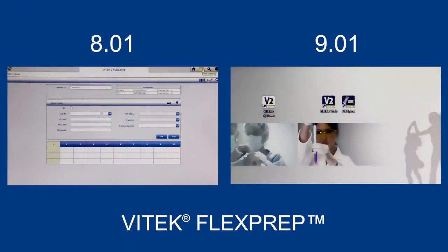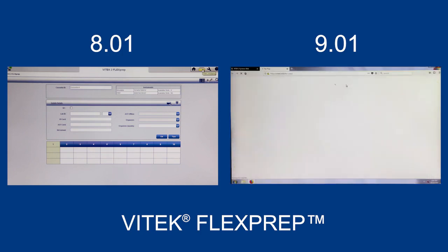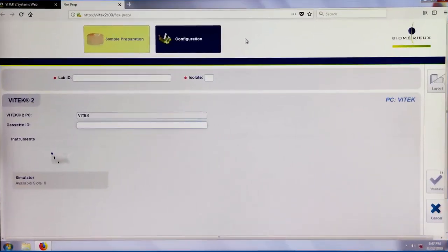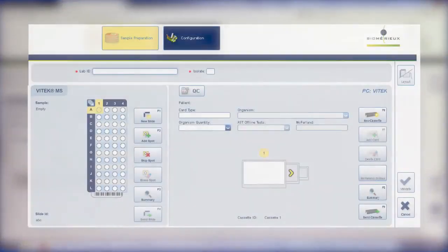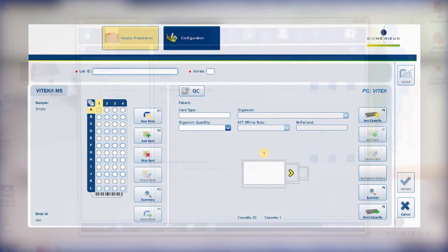Vitek FlexPrep in 8.01 was part of the web application and could only be utilized to set up Vitek 2 cassettes. In 9.01, Vitek FlexPrep has been moved to its own application. Coming soon, Vitek FlexPrep will support the definition of a Vitek 2 cassette and a Vitek MS target slide.